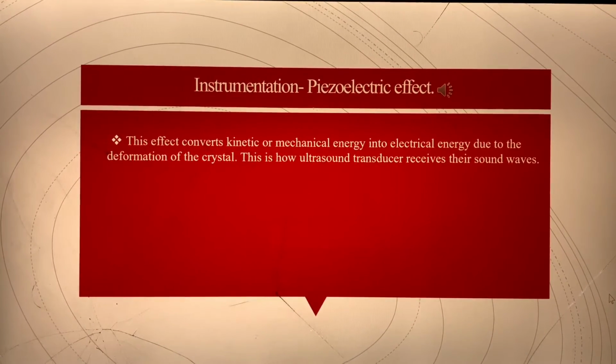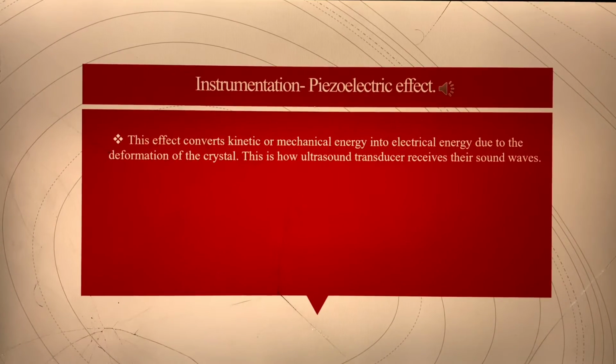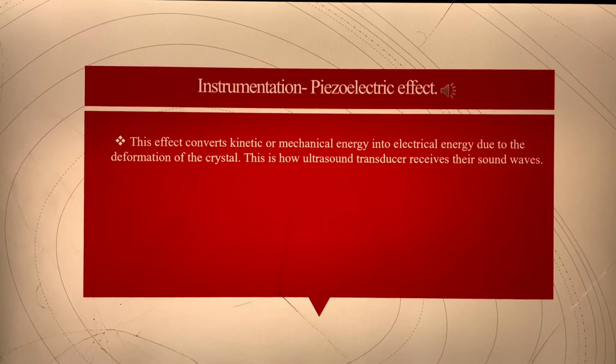Piezoelectric effect. This effect converts kinetic or mechanical energy into electrical energy due to the deformation of the crystal. This is how the ultrasound transducer receives the sound.